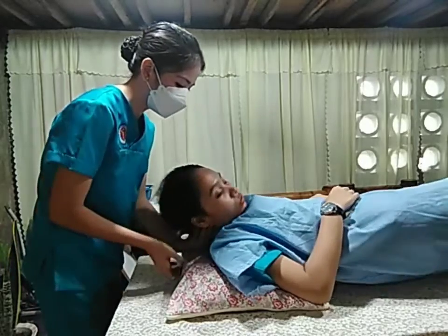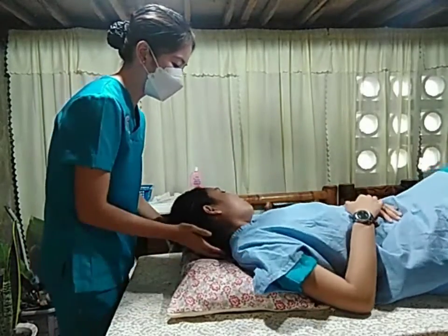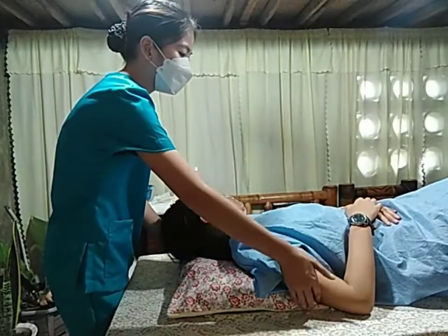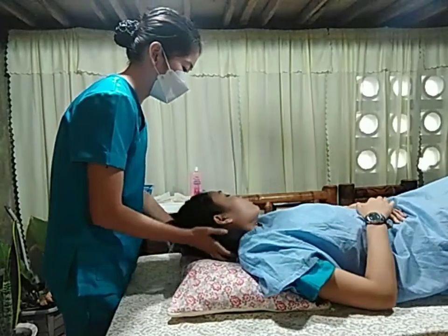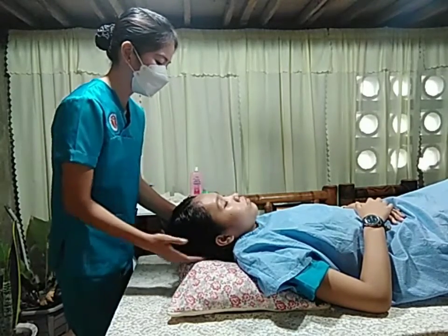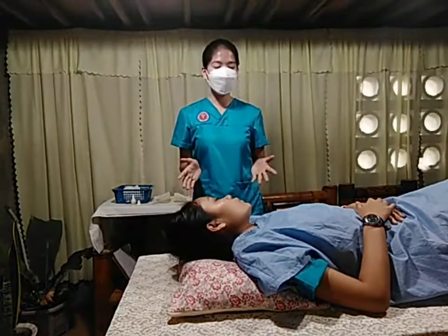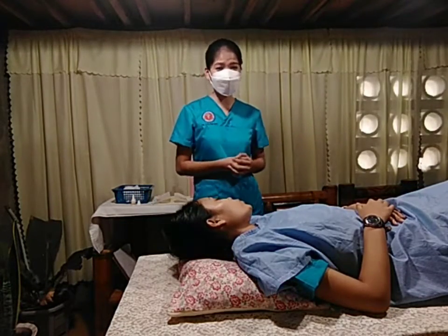And instruct the client to stay in supine position for 5 minutes. Okay, so we're done with our second axis.